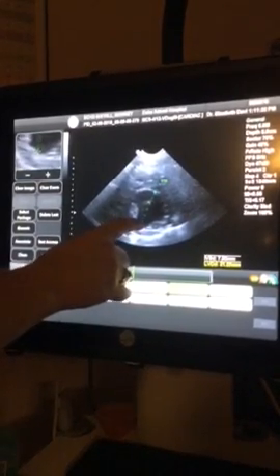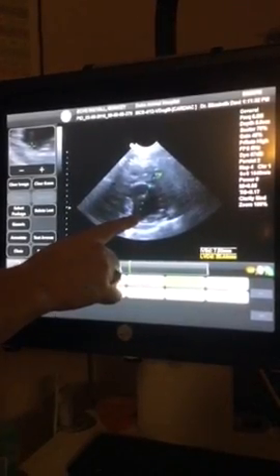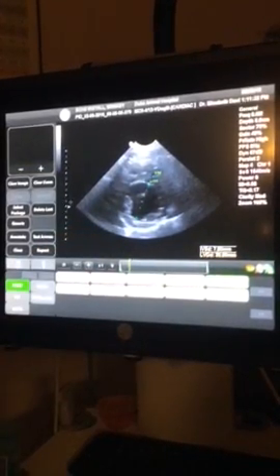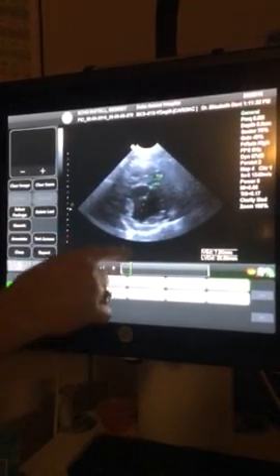If you guys saw me when I'm doing this, I'm like cursing. No, I mean you're not alone. There's several of them. You know, I just had one of my last trainings, she was real upset with that too.